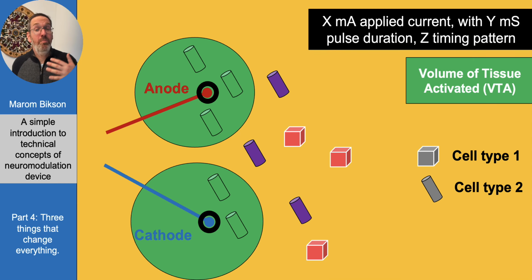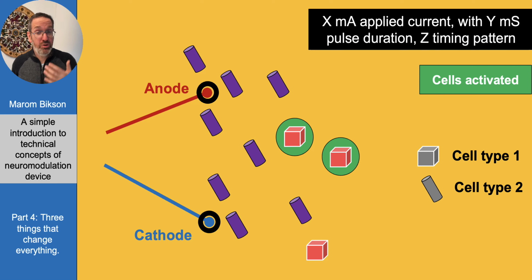We really have many types of neurons, and we also have non-neuronal cells like endothelial cells and glial cells, and we have compartments like a long axon that is just running along by itself, and the soma is really somewhere far away. And so we really need to think about cell types, compartment types, and we could have a situation where the cells that are activated are actually farther away from the electrodes than other cells.